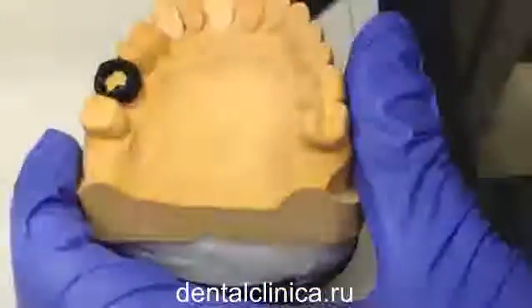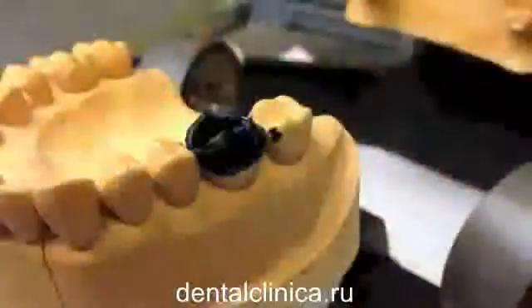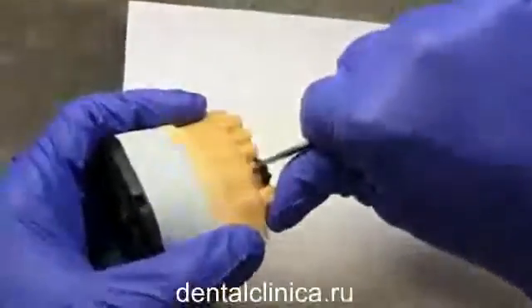Once the fish mouth is complete, you should be able to see the beginnings of the rhomboidal shape of tooth number 3. Now or later, you could use a Murphy knife to remove the excess from the border.